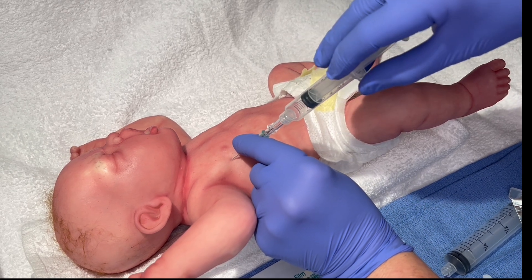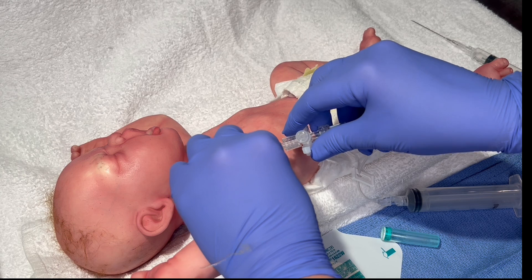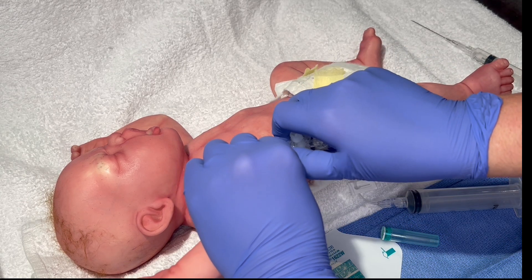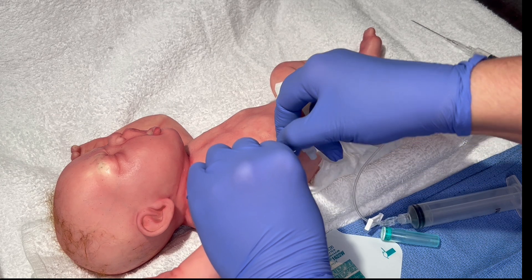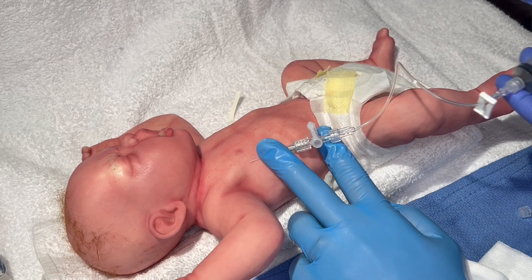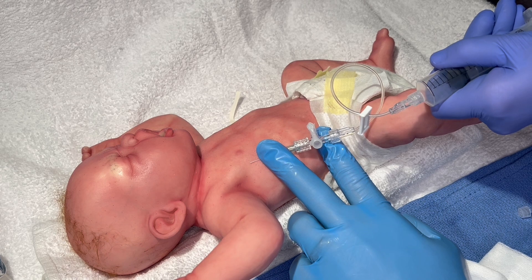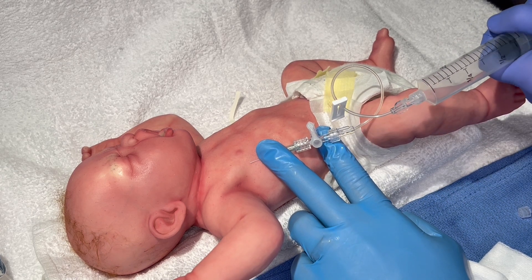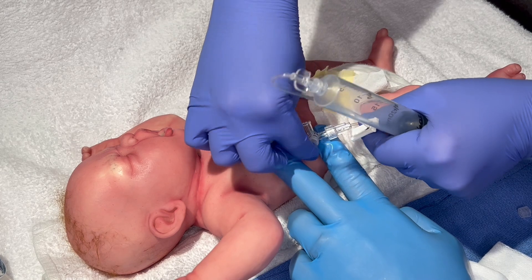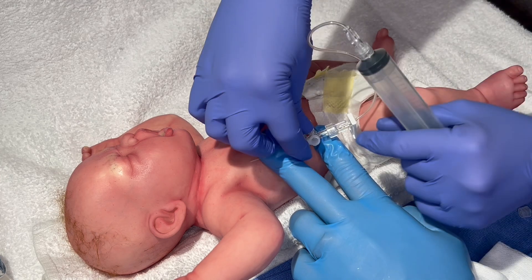At this point, you advance the catheter and remove the needle. While holding the catheter steady, you remove the 5ml syringe and attach the three-way stopcock attached to the T-site and 20ml syringe. Make sure that the stopcock is turned off to the atmosphere and on to the patient. You then begin withdrawing air from the patient's chest. You will turn off to the patient and on to the atmosphere, pushing the air out, measuring each amount.